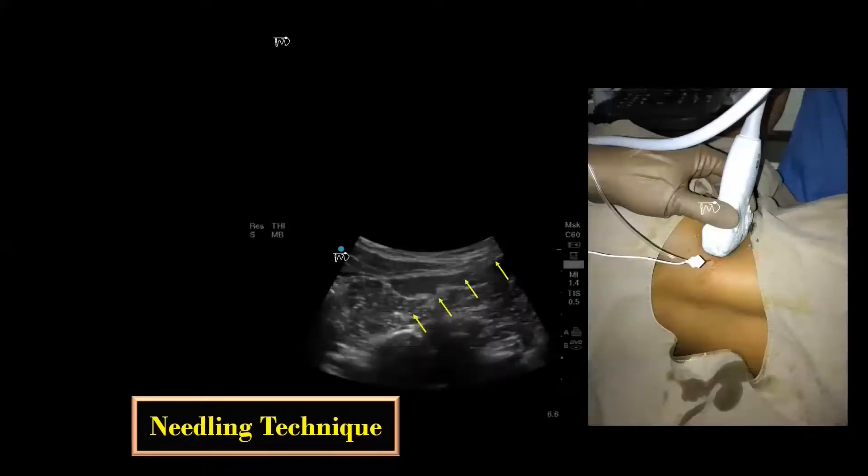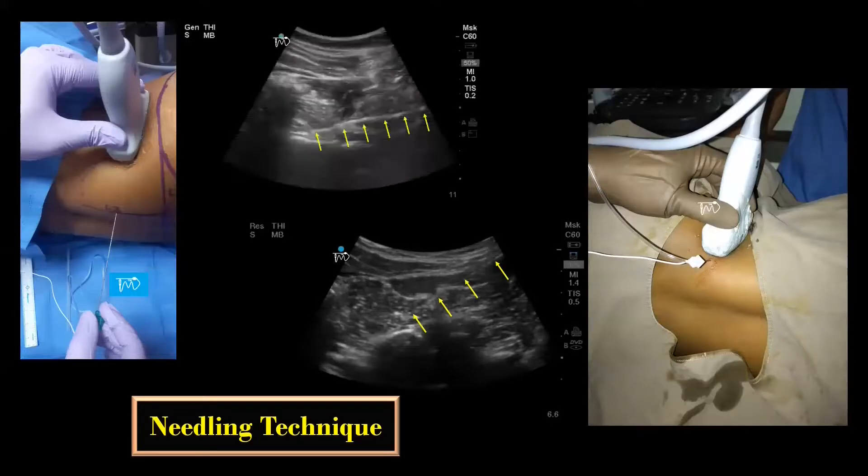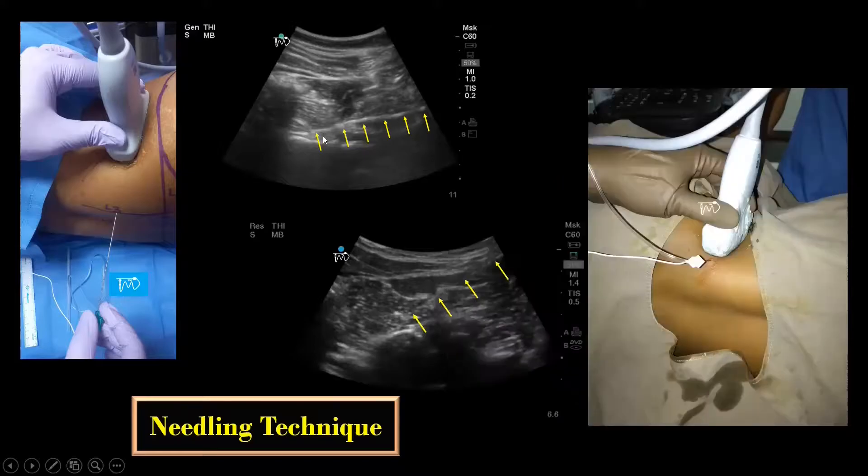The needle can be inserted either from the flank close to the probe, or at the Capdevila point, 3 to 4 cm lateral to the midline. The needle visualization, as you can see here, is better with the second technique because the needle is advanced perpendicular to the ultrasound beam. The challenge here is to start with the correct puncture angle to keep the needle in the ultrasound plane, and also the dorsal branch of the lumbar artery lies close to the intervertebral foramen, which comes in close relation to this needle trajectory.